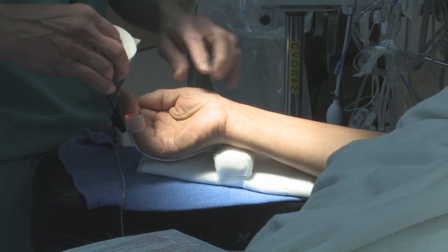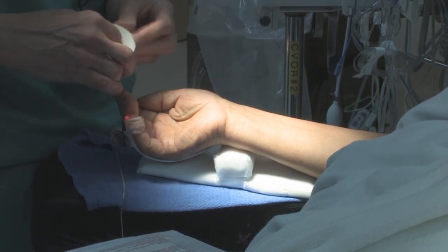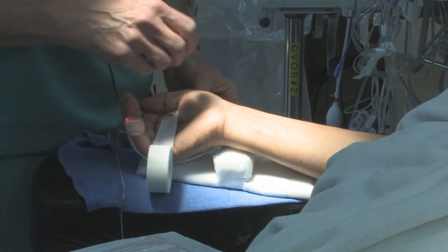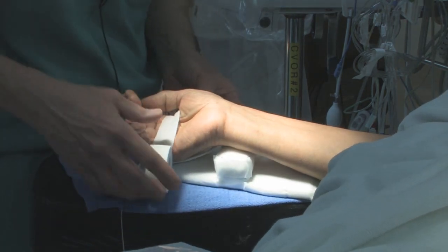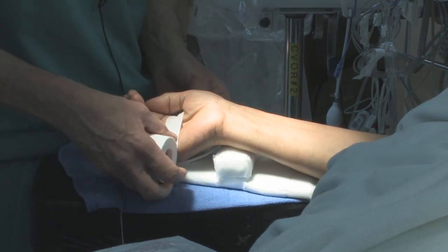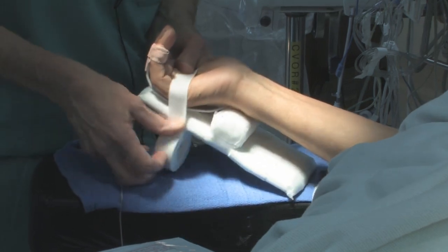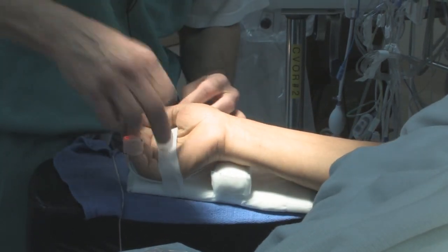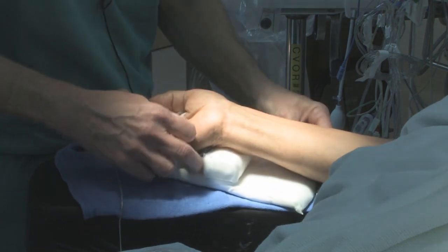Some patients are very strong, so I use cloth tape to secure the hand to the armboard. After that I use plastic tape, but do not secure the thumb or palm down initially because you don't want to keep the thumb hyperextended for hours. You may want to use it when you put the line in, so just go below and around once — don't cut off the circulation.